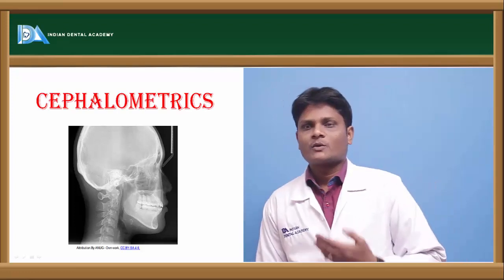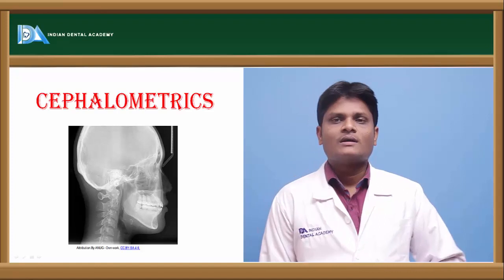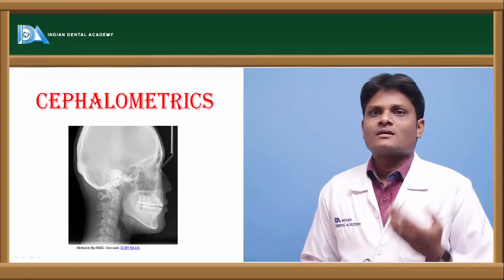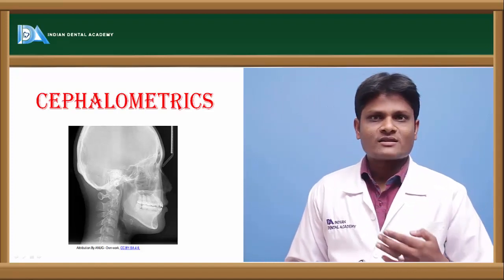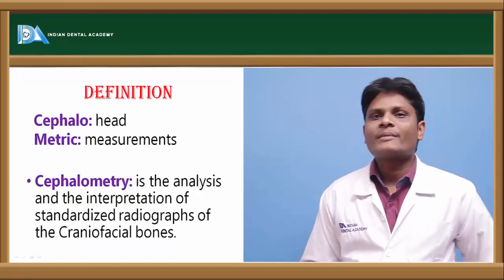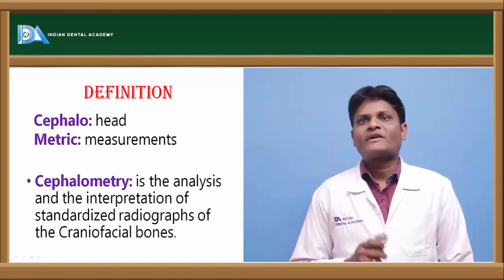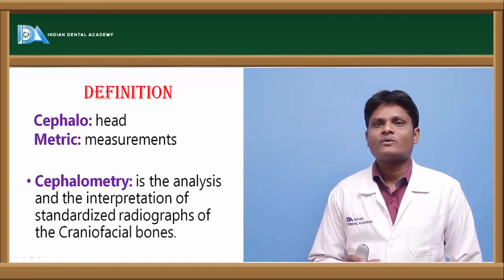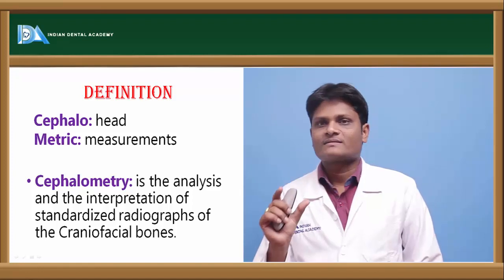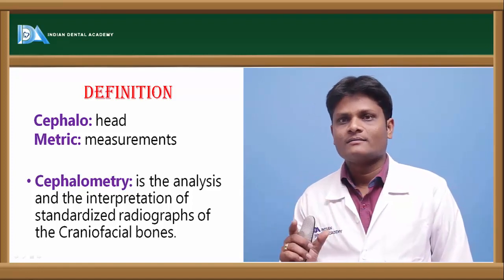Today we are going to discuss cephalometrics in orthodontics. Cephalometrics is one of the essential diagnostic tools in orthodontics. Let us look into what is the meaning of cephalometrics. Cephalo means head and metrics means measurement. So the term cephalometrics indicates measurements that are made on the head.